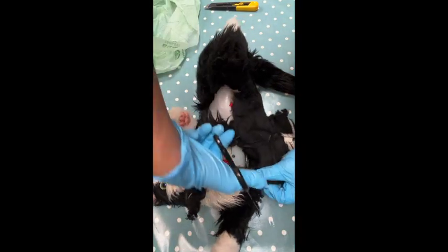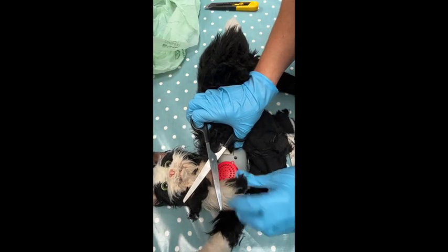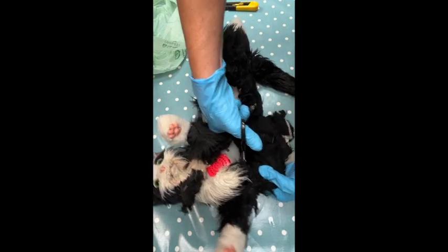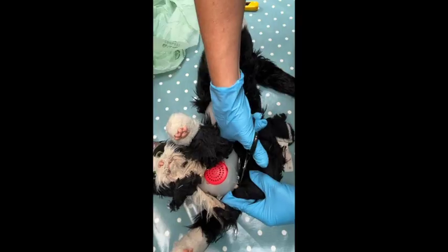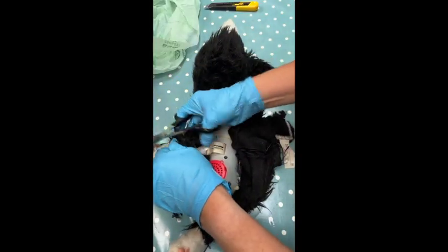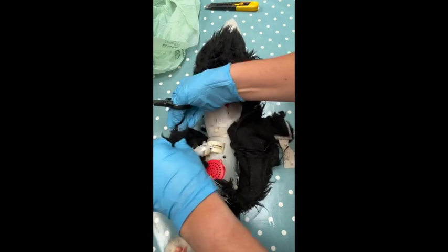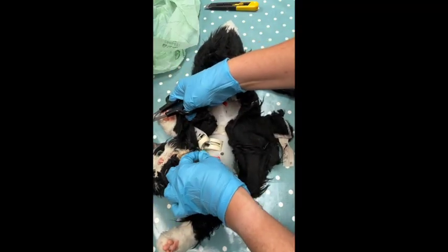I'm expecting the worst bit to be around this area, so that's what I'm concentrating on. It's sealed down here. It's like a small plastic clip where the fabric's been sewn on. So let's try releasing that. That's just sewn on there. Okay. The paws are really hard to get out. I think there might be another layer of sewing in there, so they're all articulated there. Very small articulation. It's just a little strap.